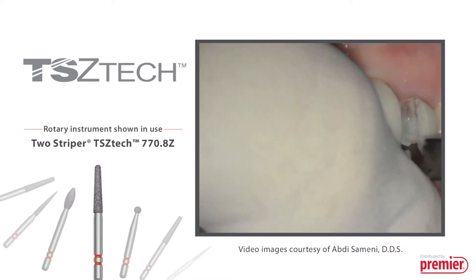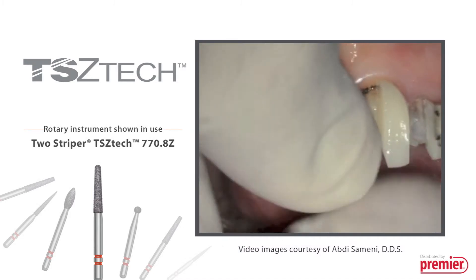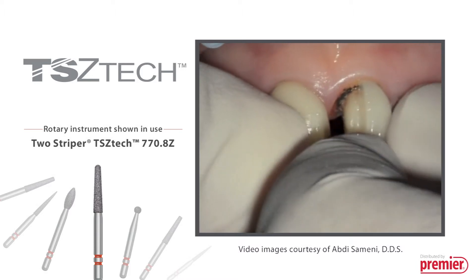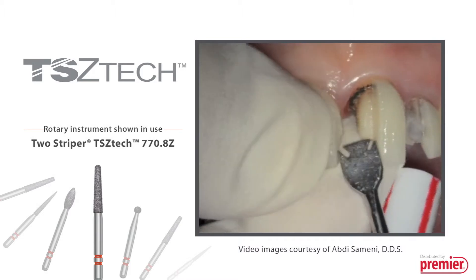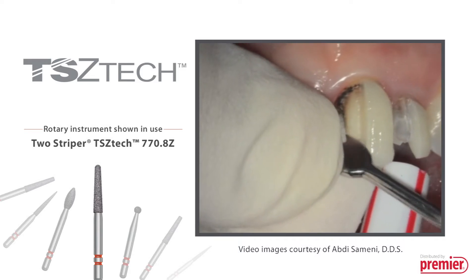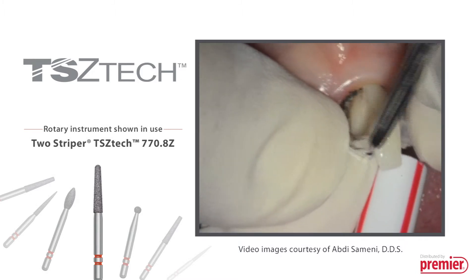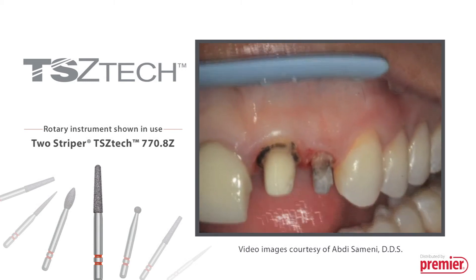Some restorations are easier than others to remove, depending on the cement type and amount used. Notice the dark staining along the gingival margin of the preparations after removal of the crowns. Proper tissue isolation is imperative when cementing all ceramic restorations in order to ensure a proper marginal seal and prevent marginal leakage, which could result in failure of the restorations over time.